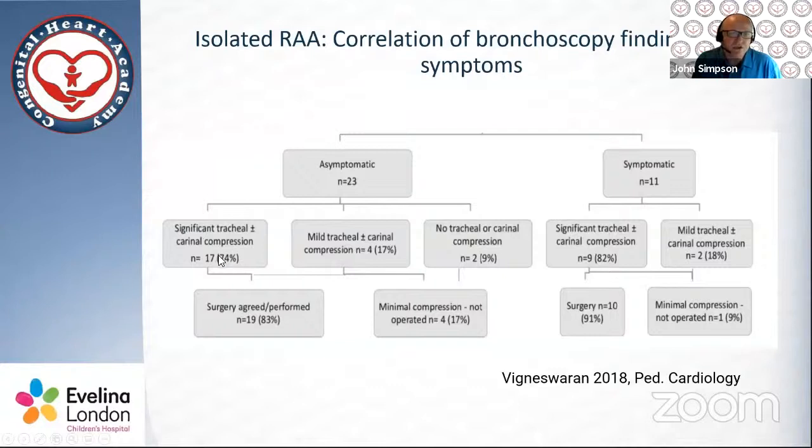And I'll show you some further slides, but I think this is significant tracheal compression in anyone's book. And we've used fairly standard definitions of what that accounts for. And the procedure we used here really is a free breathing bronchoscopy and CT scan. So we're seeing the patients as they spontaneously breathe rather than stenting the airways open with positive pressure.